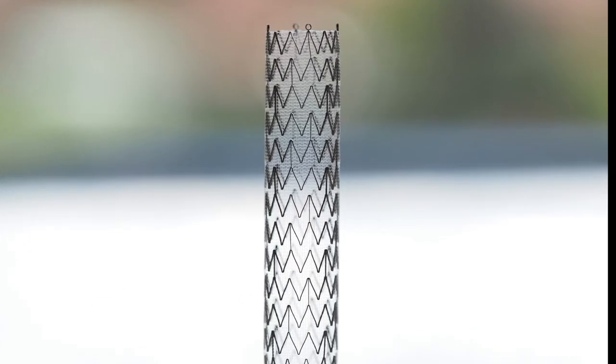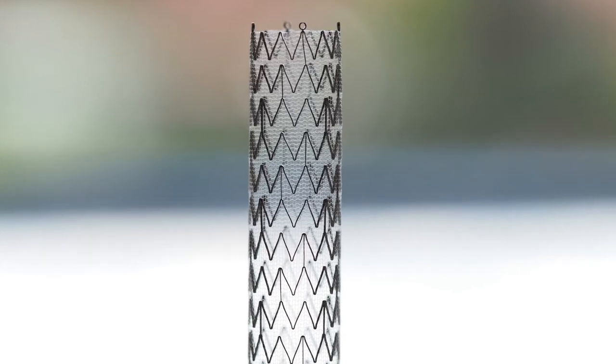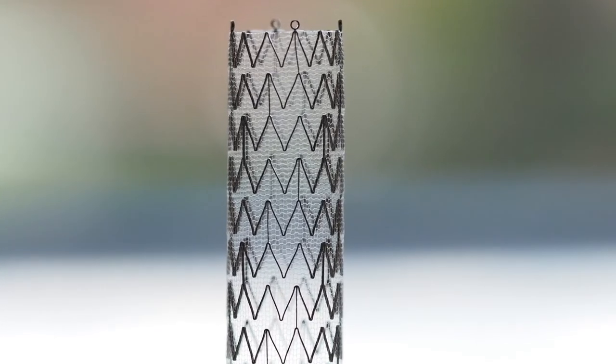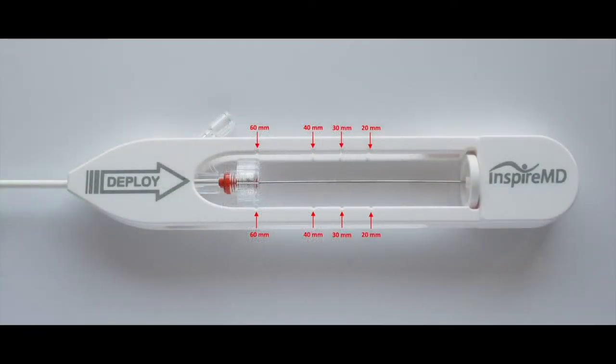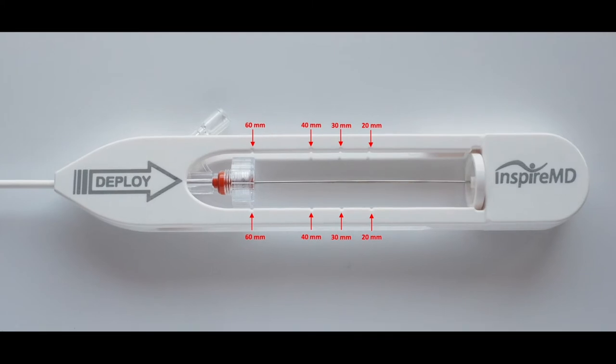As per the instruction for use manual, conduct the following steps to prepare the SeaGuard Embolic Prevention Stent System. Ensure that the hemostatic valve position matches the chosen stent size in accordance with the measurement marks on the handle.